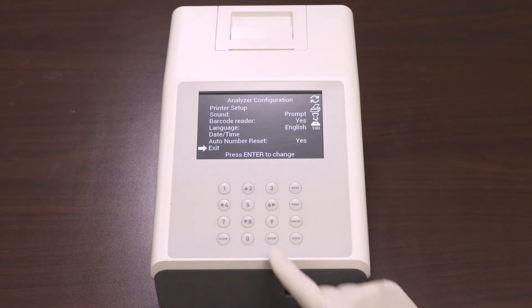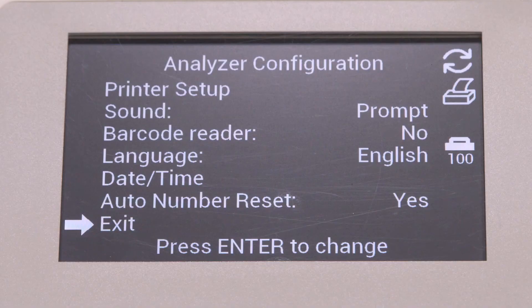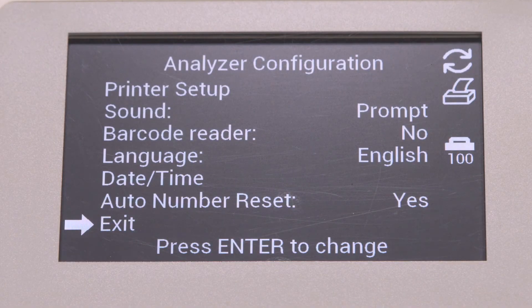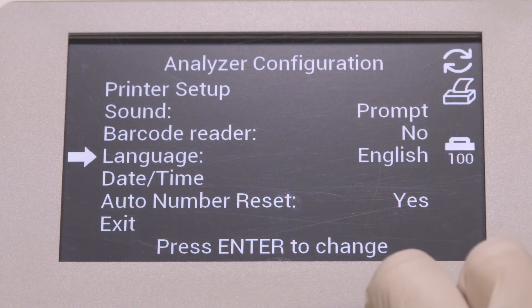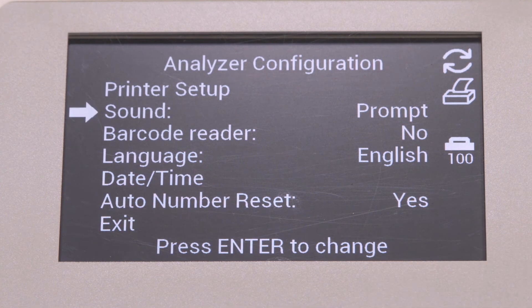Now you are back in the analyzer configuration screen. Select sound and press enter to cycle the options to off, on, and prompts.